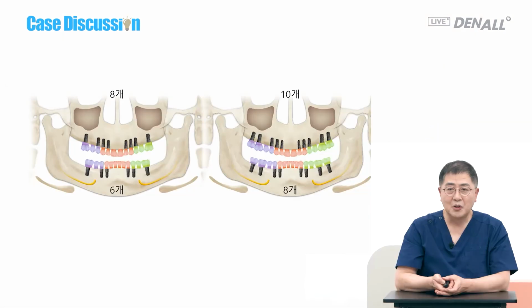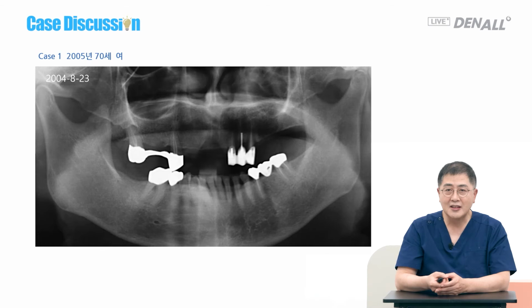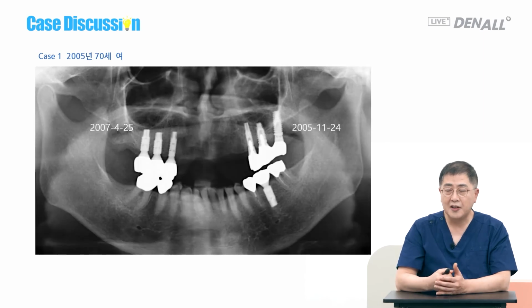Rather than a fixed prosthesis, I usually choose implant RPD. I am keenly interested in this, and I have a lot of cases of this. In 2005, the experience started here. The denture patient lost teeth. Denture was attempted with implants.